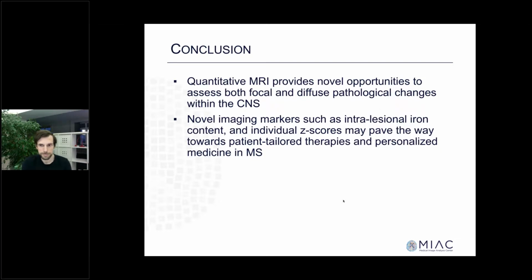Okay, great. So I have another question from JC Hood. About acquisition protocols, are the sequences needed for these modalities available on most clinical scanners? From what I have seen, some of these sequences need fine tuning, so I'm wondering if this is easily deployable in a clinical trial. Yeah, that's true. I think for QSM, it's the hardest to get this into a clinical trial. But for example, T1 mapping, it should not be a big issue anymore because MP2RAGE sequences are standardized nowadays and available for a broad set of Siemens scanners.